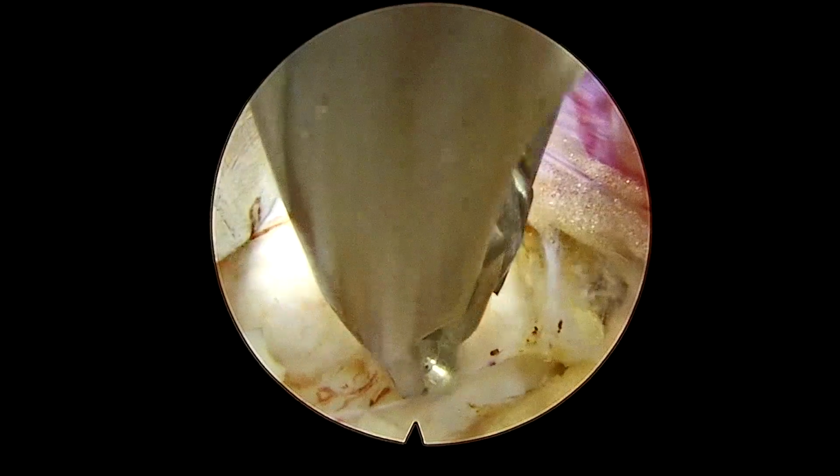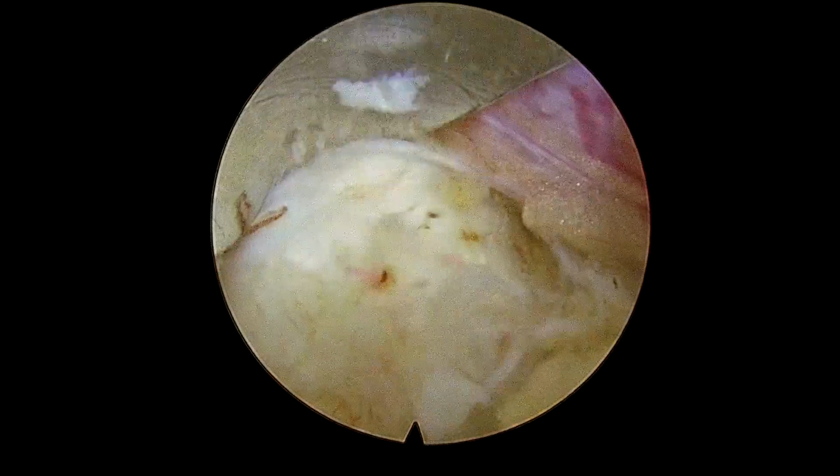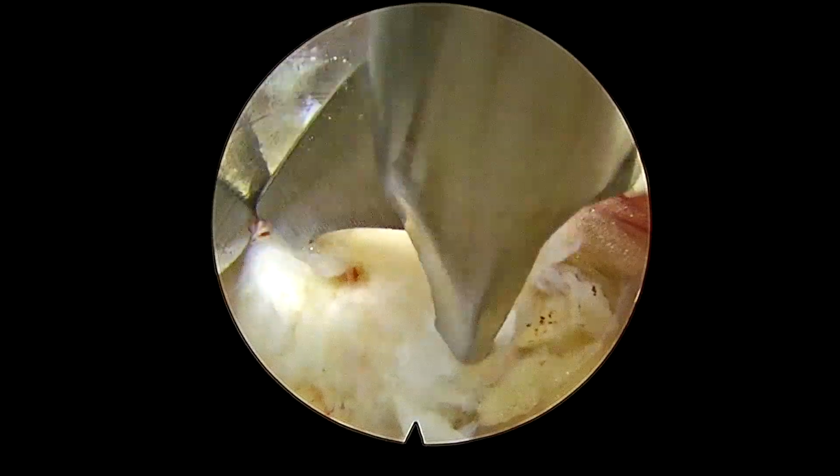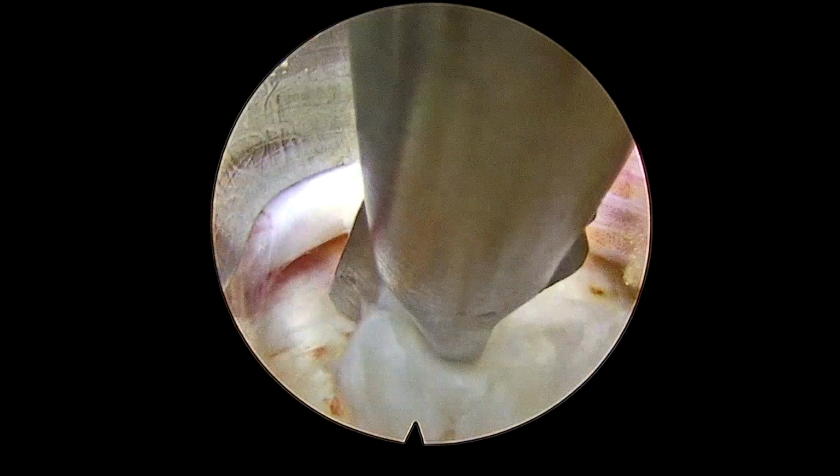So now with the help of this annular cutter, I am just cutting the superficial layer of the annulus. So this is the contained disc. The fragment is subannular. Now you can see here the fragment is coming out of the annulus.